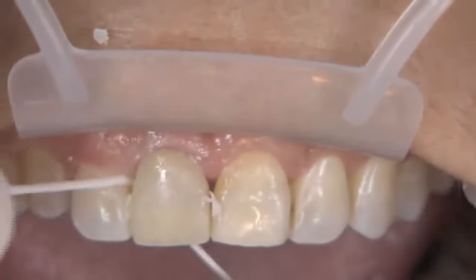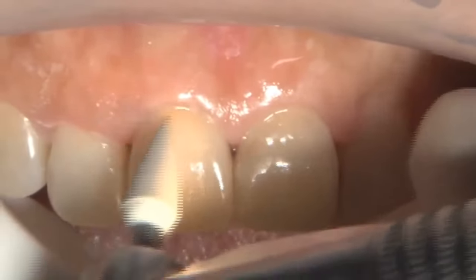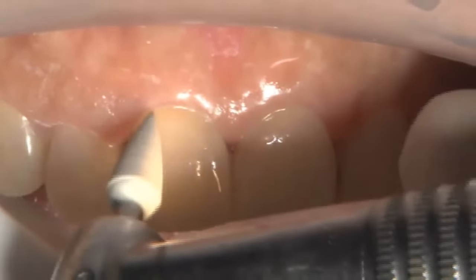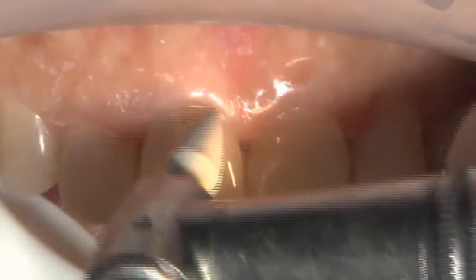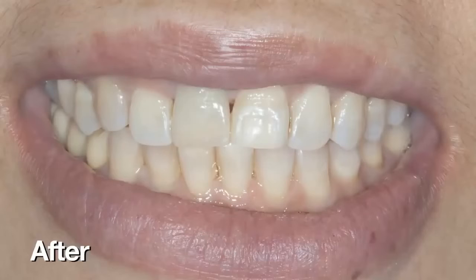I'm using some super floss — you can see that thick little portion there that does such a great job of picking up all those extra pieces of cement in the approximal areas. And then a polishing tip to go in and just smooth off any little pieces that might be there at the margin, or if we feel like we need to put a high shine on that restoration in the gingival third.